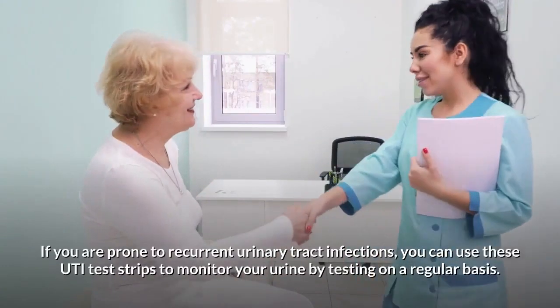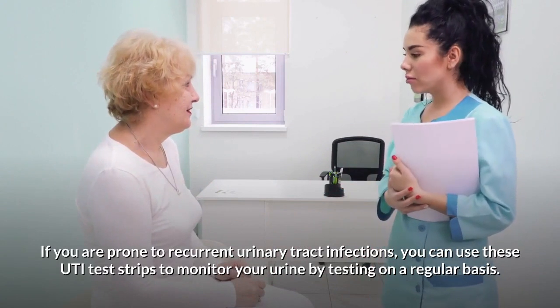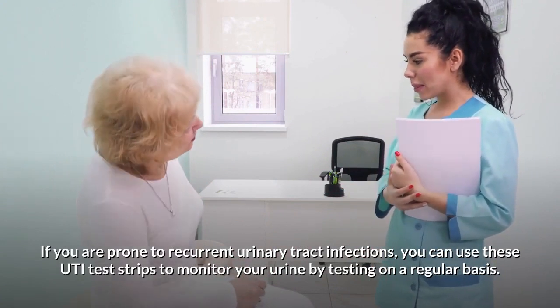If you are prone to recurrent urinary tract infections, you can use these UTI test strips to monitor your urine by testing on a regular basis.